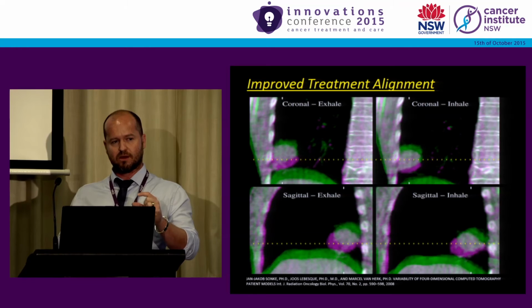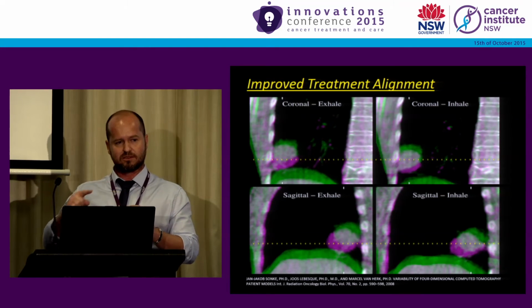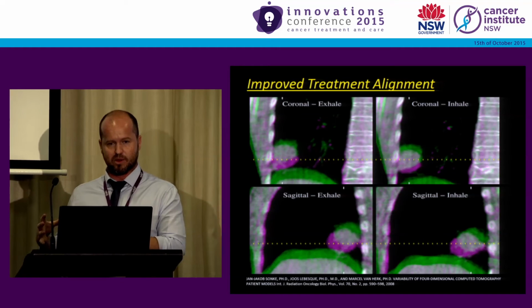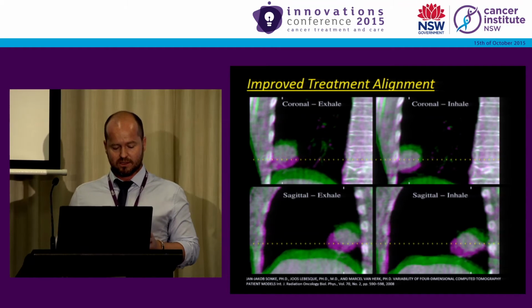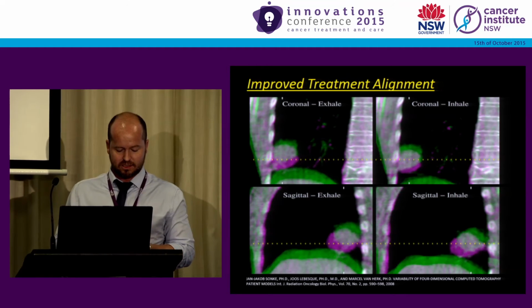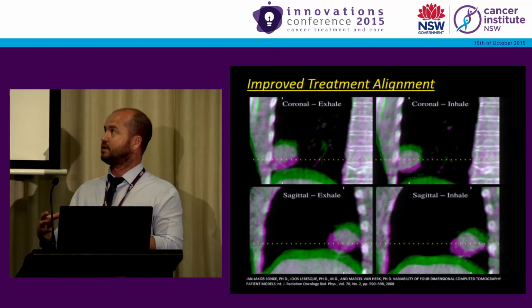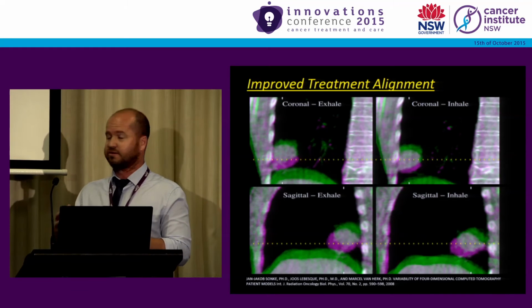So reading into that, what we establish is that the trajectory of the tumour is actually quite stable. The mean position of the tumour within that trajectory is very stable, but with respect to the bony anatomy that we align to, it can sometimes be quite different. So 4D CT gives us a way around this by reconstructing that average position within the trajectory. And if you can use this to align to the cone beam, you can potentially reduce some of these inaccuracies.